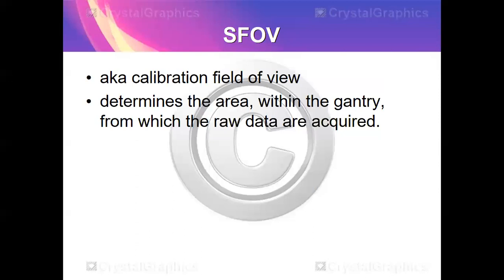So other term for SFOV or the scan field of view is calibration field of view. It determines the area within the gantry from which the raw data are acquired. Raw data kasi ito, as I mentioned, ito talaga yung actual area of interest.